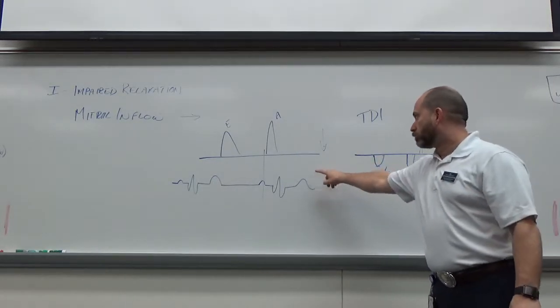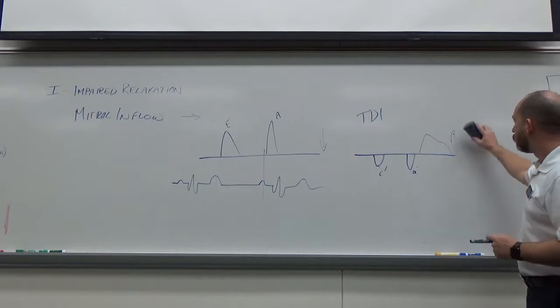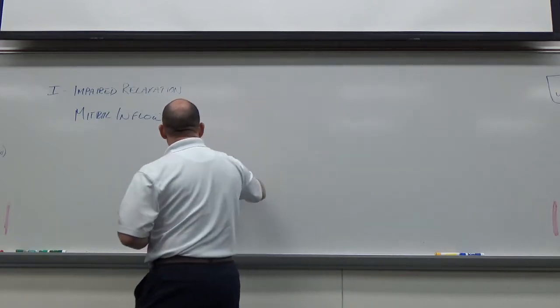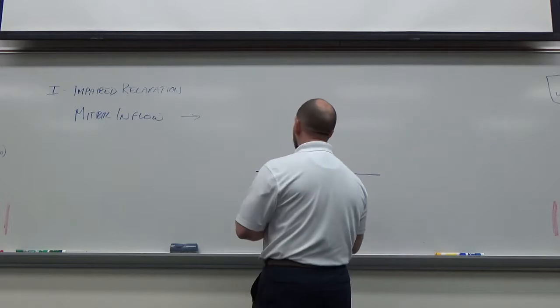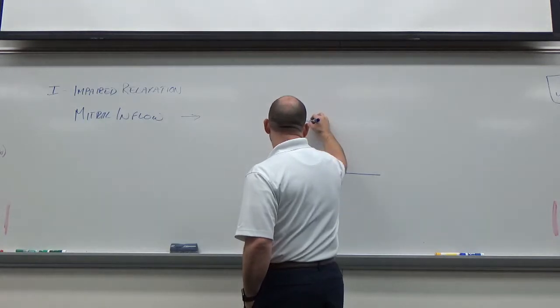So for this inflow and tissue Doppler, what does our pulmonary vein look like? S and D wave. S and D are what? Similar in velocity, or is S bigger? S is bigger.